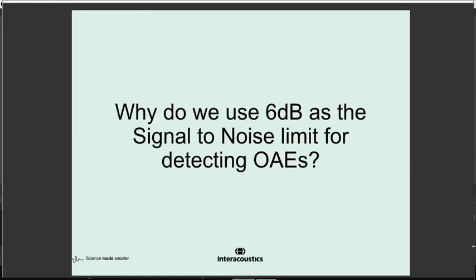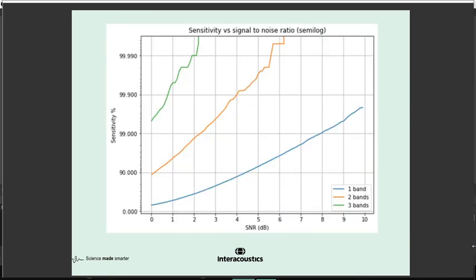Yeah, and I think, over the years, we've come to a fairly standardized value. Most people talk about 6 dB, and it's derived empirically over years. And behind that, there's a lot of science, and it's best at the end of the day to leave the protocol to the manufacturer. So what it's delivered with is probably the best thing. That's because each manufacturer knows their equipment best, the way they process the noise. And I hope they all do the kind of thing that we do, and I'll just briefly go over this.